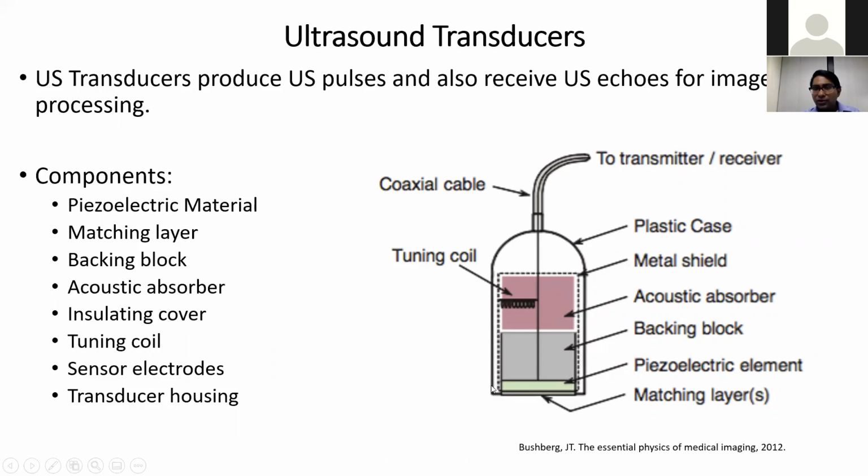An ultrasound transducer has a few main elements. I'm going to walk you through the main elements. One is the piezoelectric element, which you see here in green. When you apply an electrical voltage to it, it generates sound waves which propagate into the media. Then there's a backing element which basically absorbs all the sound waves that go inside the transducer, so that you don't have waves traveling inside the transducer and creating noise for you.